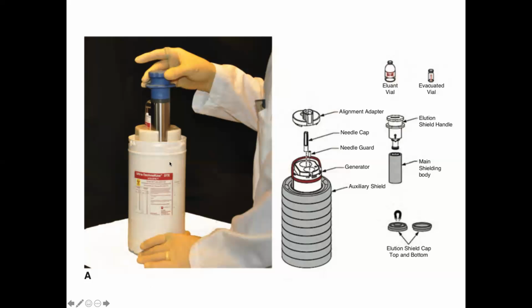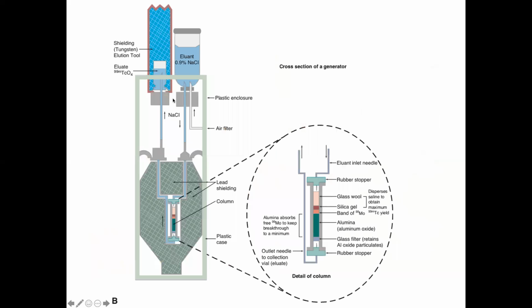So this arrives once a week at your lab. Inside that container, this is a radiation-proof container, because if someone is carrying it across the room, you don't want radiation coming out of it.